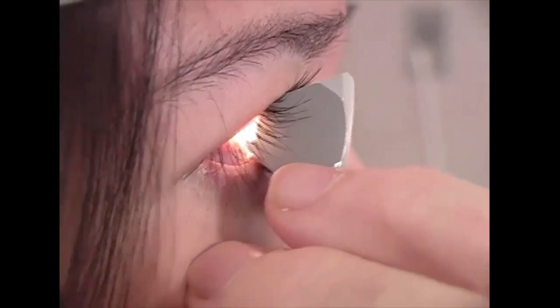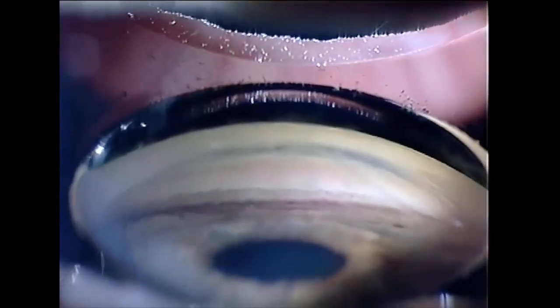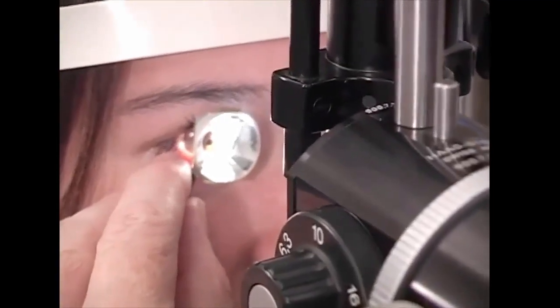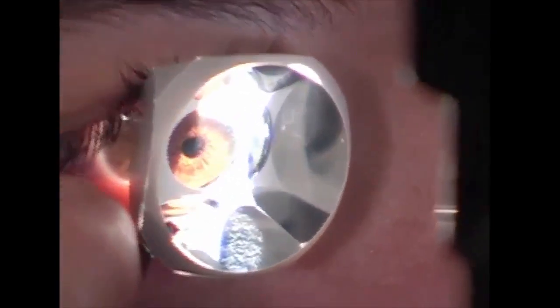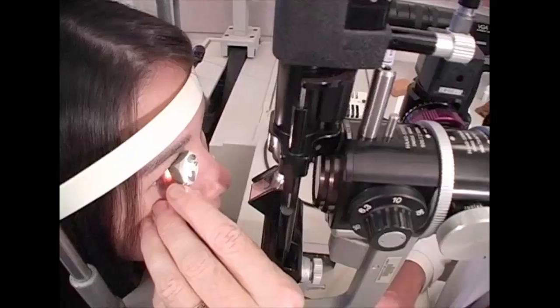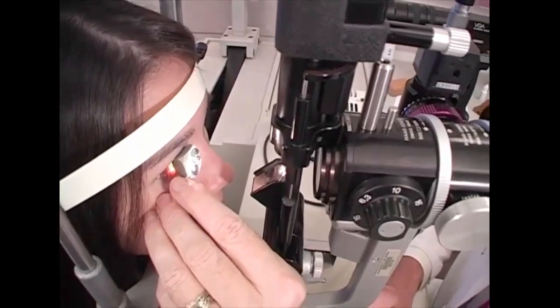You can see I've braced against her face, so as she moves, I can keep up. And if I want to indent, I just push on the lens. You can see corneal folds there. But indentation is a little bit beyond what we're going to talk about in this lecture, because it's a little bit more advanced.